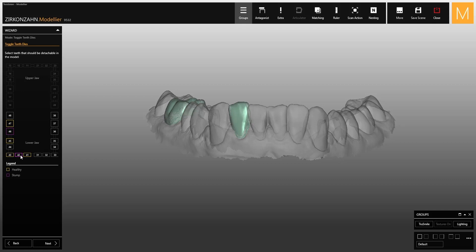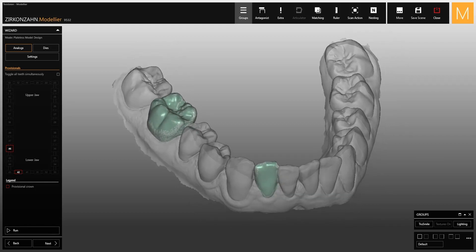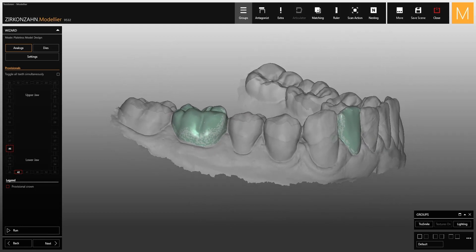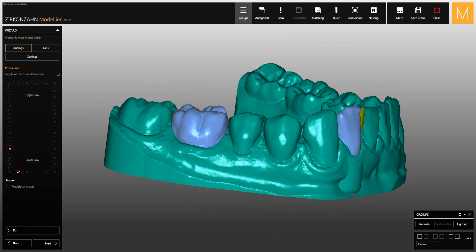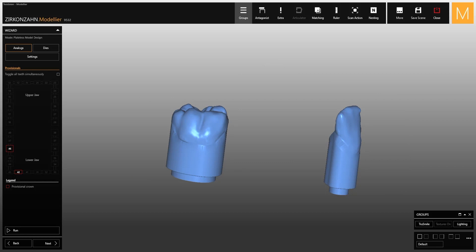Within the arch preview, you can select the teeth as temporary crowns by clicking on the individual teeth of the reconstruction, which will appear in red. In this way, when you create the model, removable abutments will be inserted with the modeled anatomies.